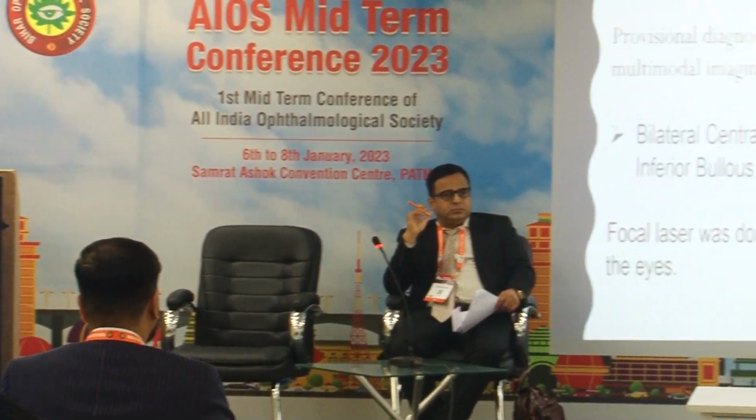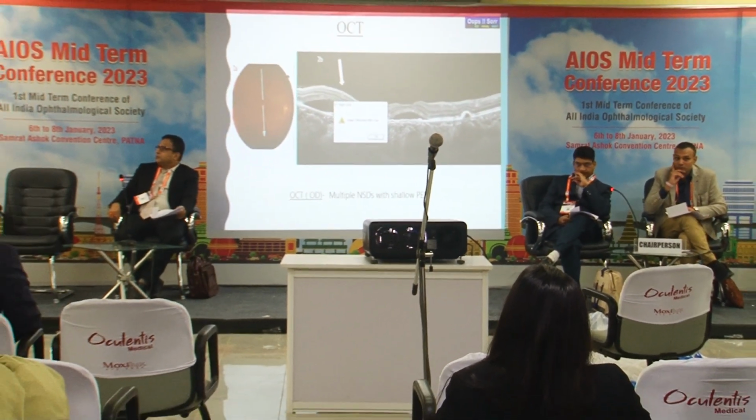Have you noted pachychoroid in your OCT? Pachychoroid, sir? On OCT? In this picture, the size of the choroid and choroidal vessels. So is it the cause? Not a pachychoroid, sir. This is not a pachychoroid? No, sir. Okay, so why are you saying this is spontaneous? Because the other causes couldn't be ruled out, because we say that RPE rip is usually seen in patients.